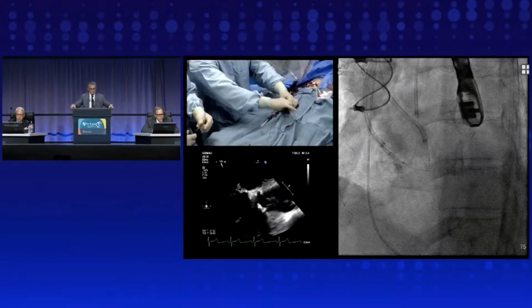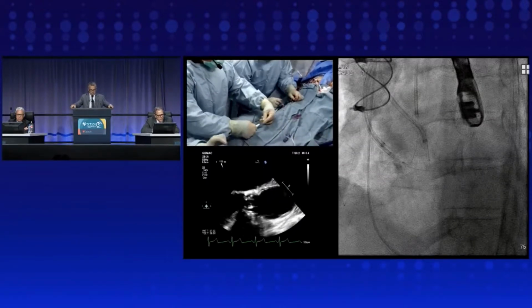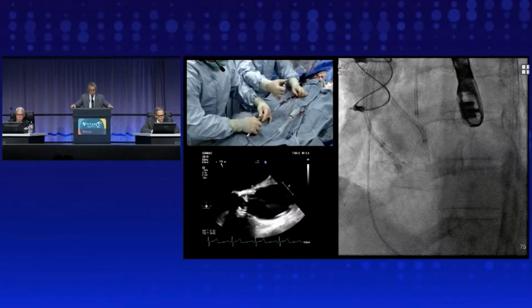Hey guys, this is Maurice Serrano. You're putting this through a calcified valve. Any concern about what happens to a calcified valve when you try to cut it?